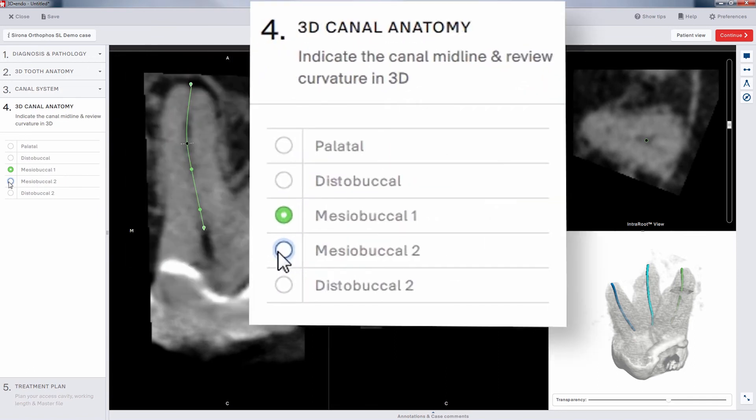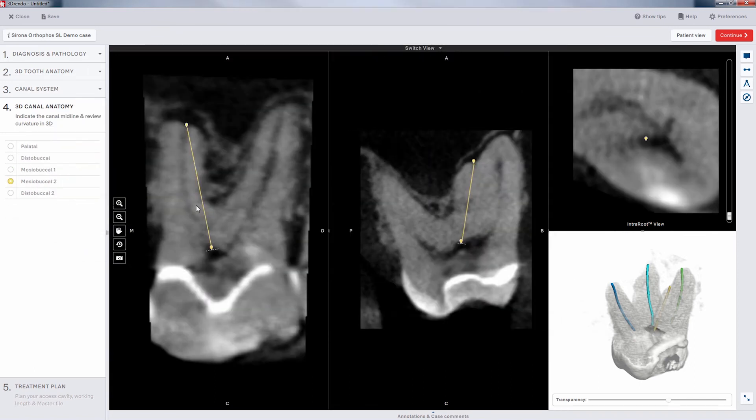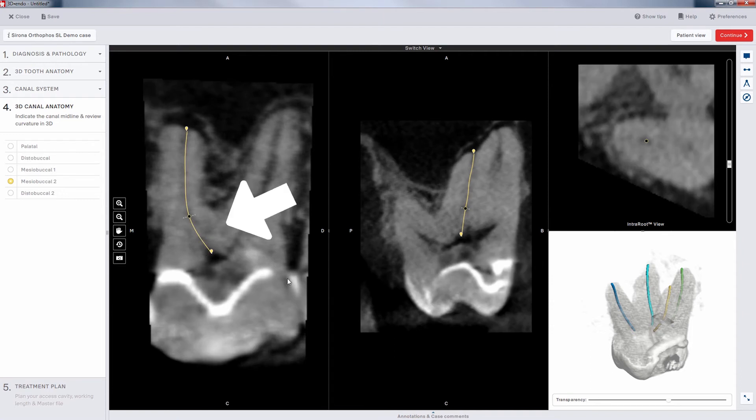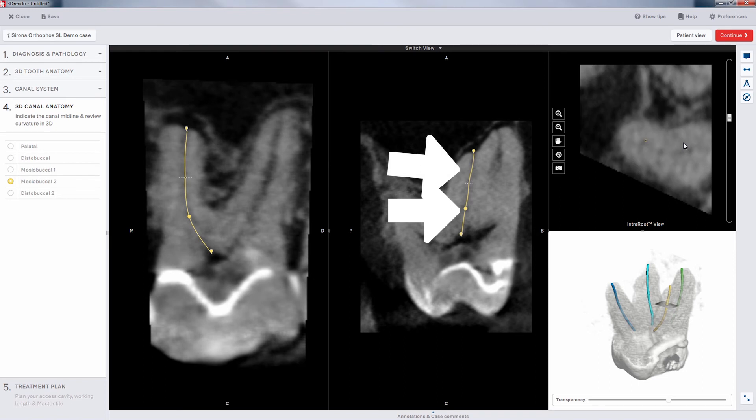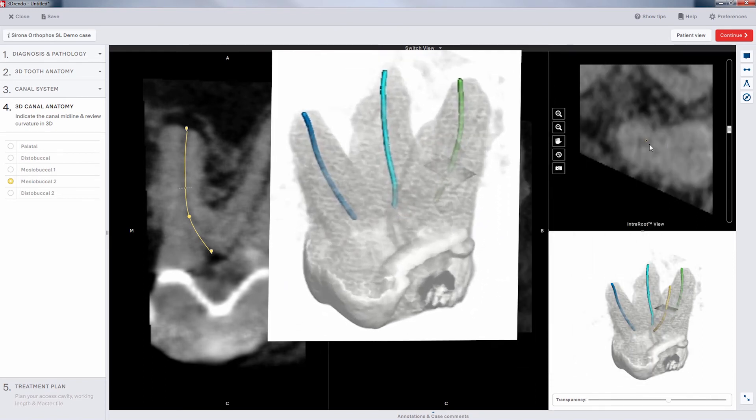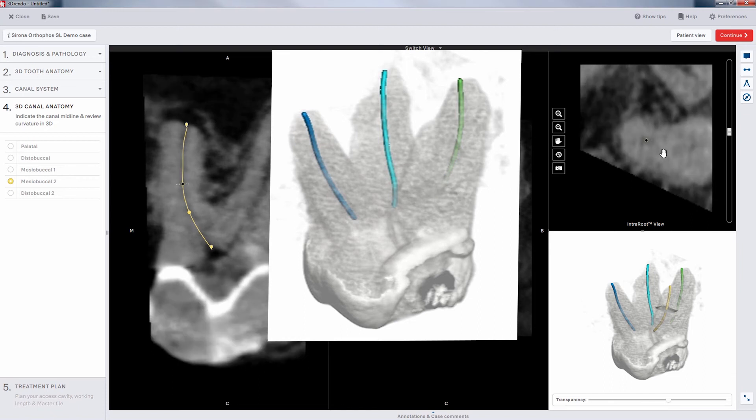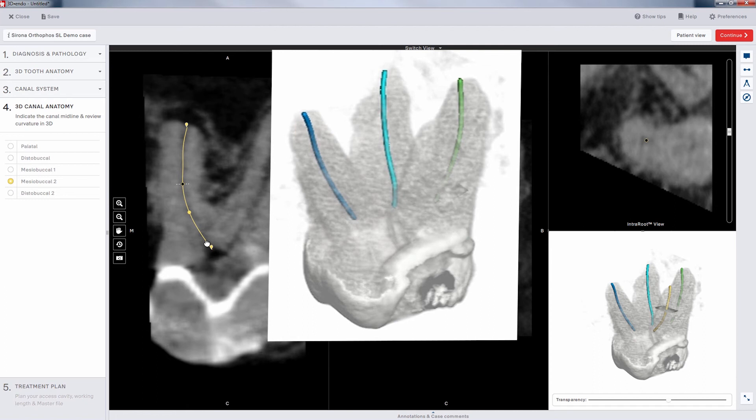The MB2 needs just one adjustment point in the center of the root when looking at the left-side window view. Two or three clicks in the center view, and we get better alignment there. The intra-root view is helpful in this particular canal as we adjust the trajectory. You do not need to spend a lot of time on this step.